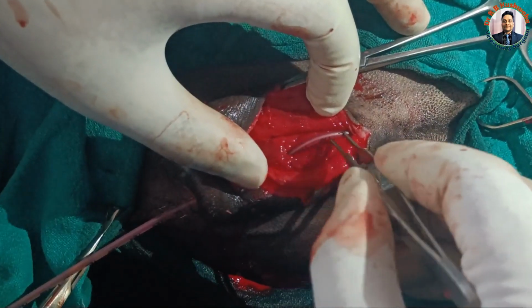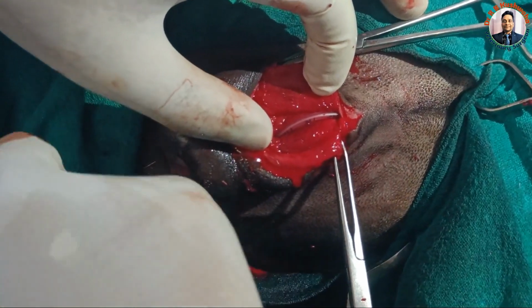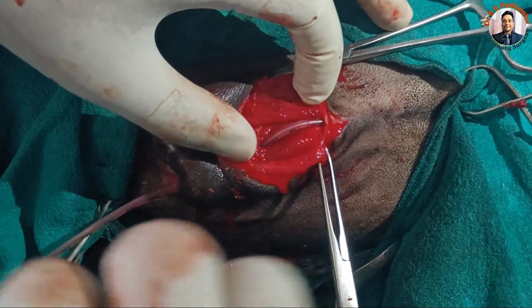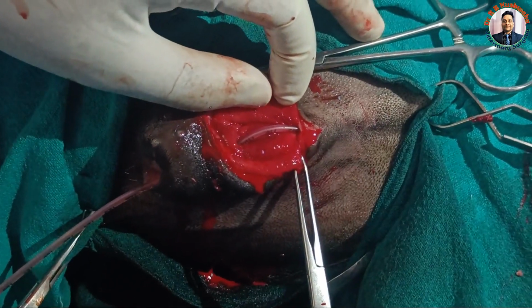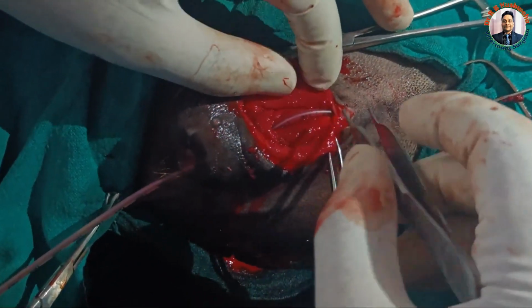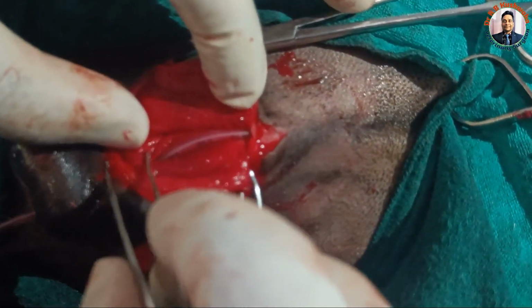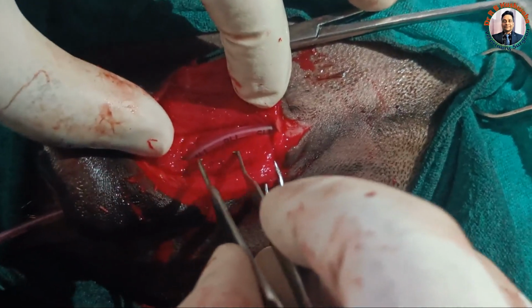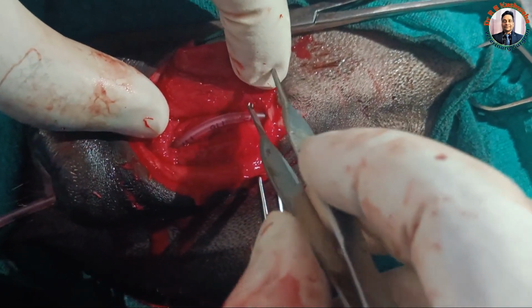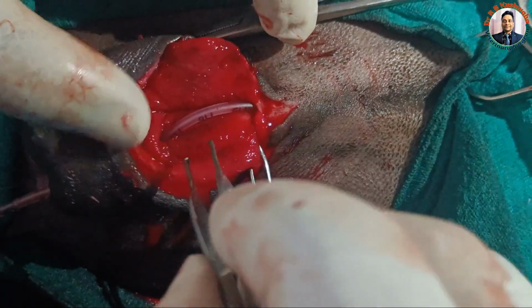We have passed this catheter caudally and anteriorly, and you could see here the catheter has come out from this prepuce, and urine is also coming drop by drop from the catheter. So now next is the urethroplasty procedure. We make an incision from here like this up to this opening, and then from here like this. So we make an opening like this, and then we suture this urethral mucosa over the catheter to make a small lumen, because here the lumen is bigger.